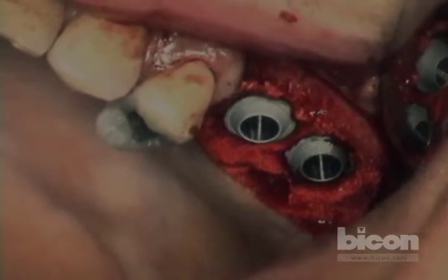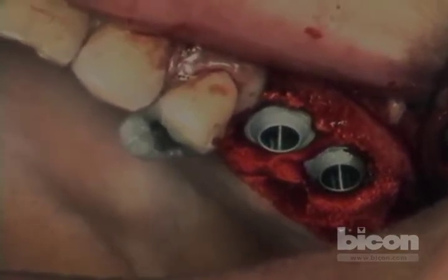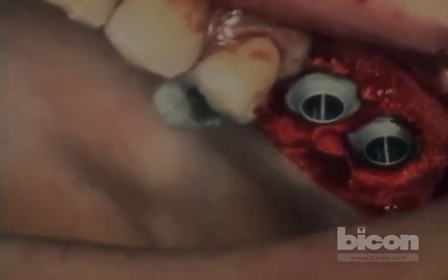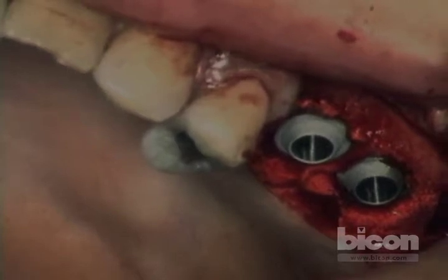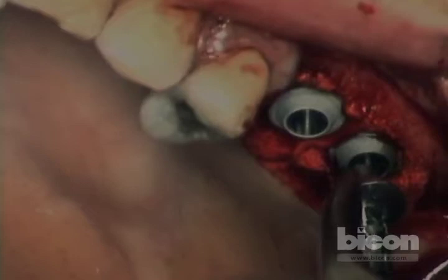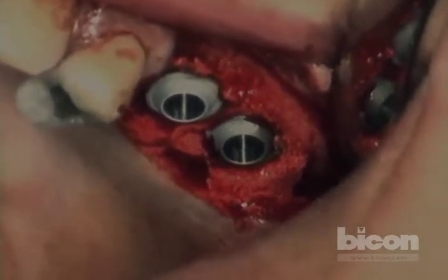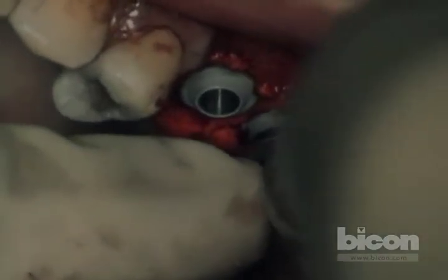By putting the abutment on now, that will act as a nail head. For those of you who've used the sinus lift abutment, it was designed specifically to have an oblong shape. You can choose which way to place it based on the anatomy of the flap, the bone, and the area where it needs to work. In this case, I'm going to put it with the longer part bucco-palatally, because that will catch the edges of my osteotomy and allow us to seat the implant fully with the abutment.